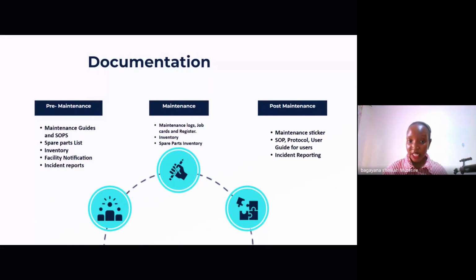Then for post-maintenance, we have the maintenance stickers that are left on the concentrators, SOPs, protocols, user guides for users. This can be based on the maintenance. You notice that the staff haven't been doing a great job, so then you draft a better user guide to support them to use the equipment better, and incident reporting.